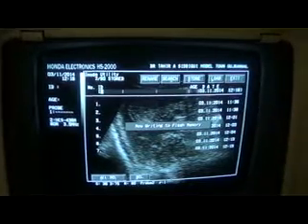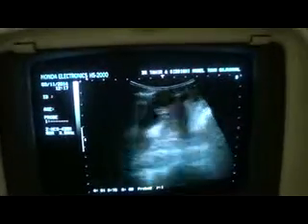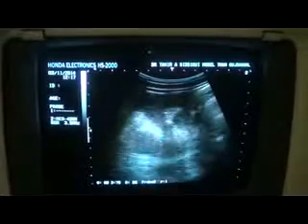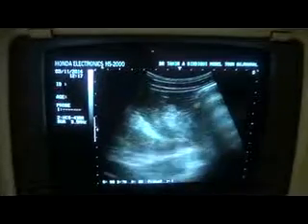So matted bowel segments with this appearance and the verbal history. This is a case of peritonitis with matted bowel segments in the lower abdominal quadrant. This is the left side, and you can see the movement of the bowel is so slow.